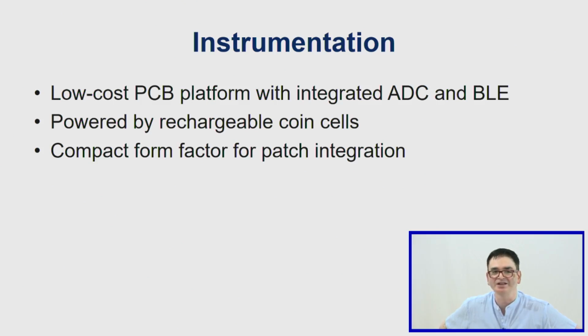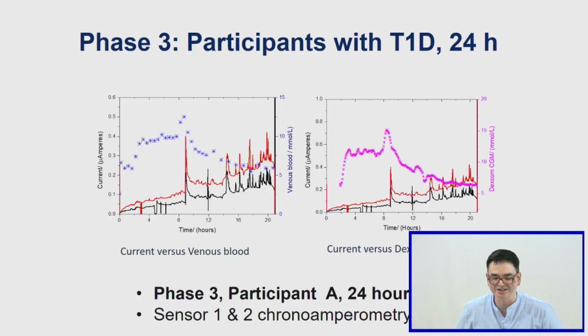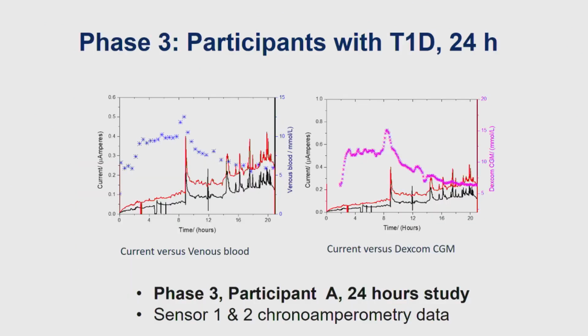What you need here, I think I showed you that instrumentation slide, if you remember, wherein basically, as I said, it's much more convenient if you have devices on a PCB. So you can have a potentiostat on a PCB, you learned that yesterday. You can have a microcontroller there with all the algorithms, with the AI model, which can then help you in filtering the data and giving you clean output values or good predicted values as well, taking into account all the things that undergo, including biofouling as well.